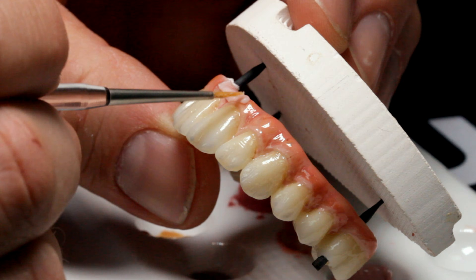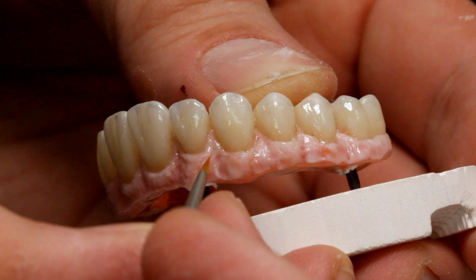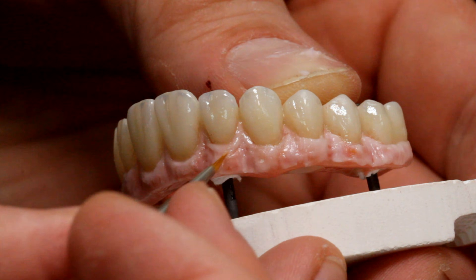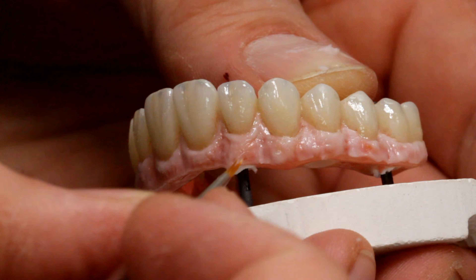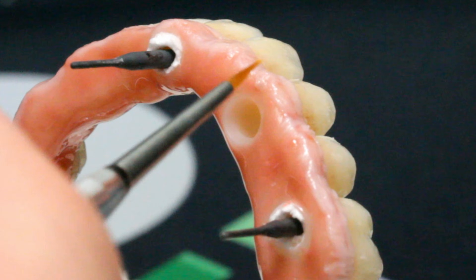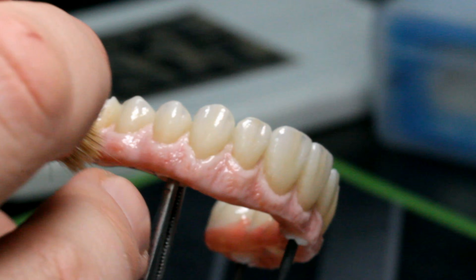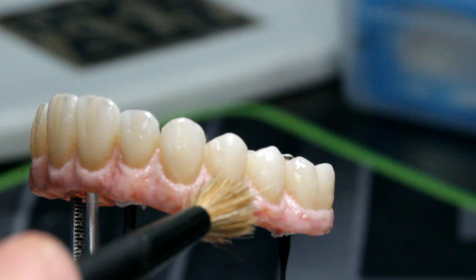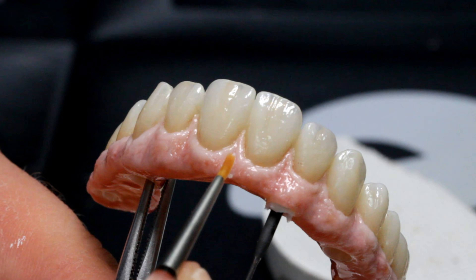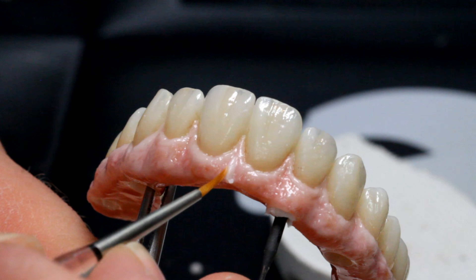Structure is a special kind of porcelain, and if you are an experienced ceramist you will find it intuitive to use. Apply only a very thin layer — if you don't see the underlying veins or colors, it is too thick and will cause cracks during firing. The goal is to sculpt another dimension of character and make the gingival look three-dimensional with colors still shining through. Tissue is not perfect, so don't try for symmetry. Blend it out toward the basal areas to avoid hard lines. With a Mio large brush, carefully tap the finished structure layer to create small pits. I use Structure Frost to build the labial frenum, but be careful since Frost is high in value — only use a small amount.